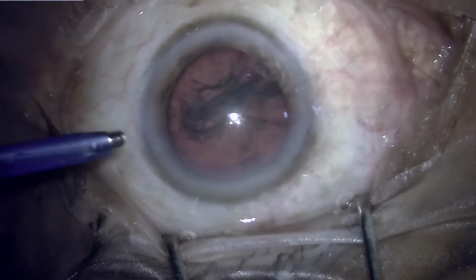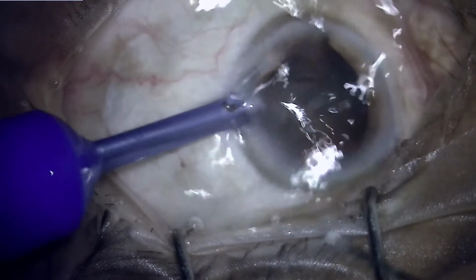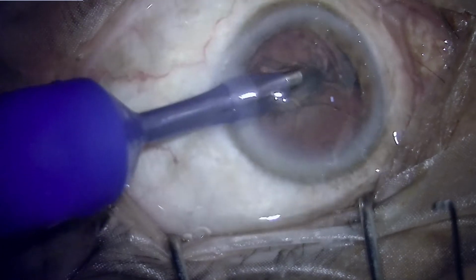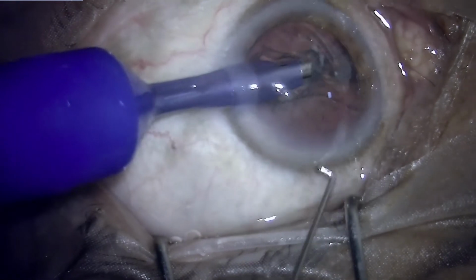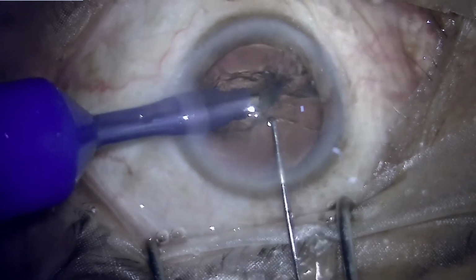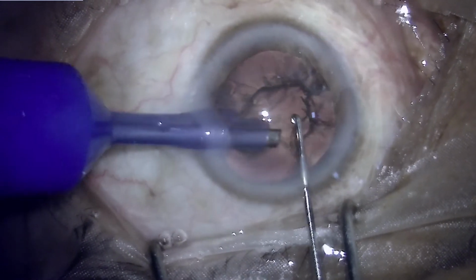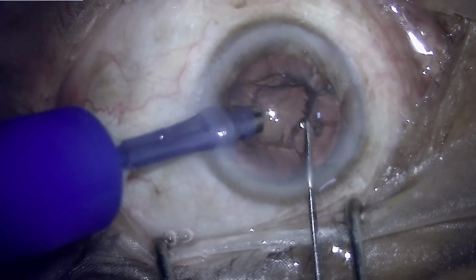So now proceeding for phacoemulsification, and the unique problem with these cataracts is that they are clay-like and they are amorphous and they are not like a formed hard nuclei. So some amount of hardness is important for phacoemulsification, because the phacoemulsification process involves a proper disassembly of the nucleus by creating cracks in the nucleus. And as we can expect, cracks can be created only in a hard brittle object rather than in clay.